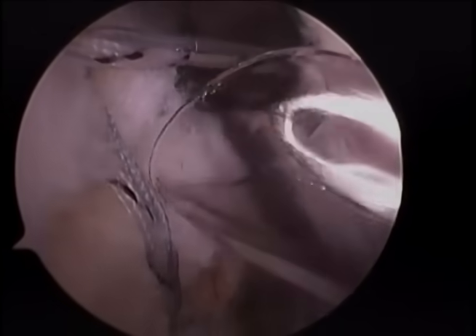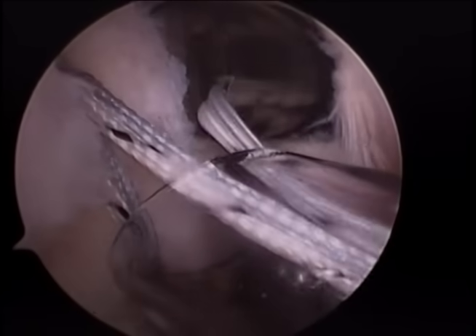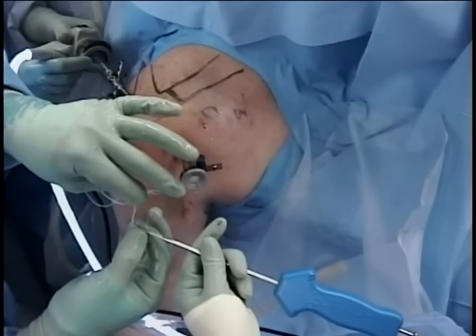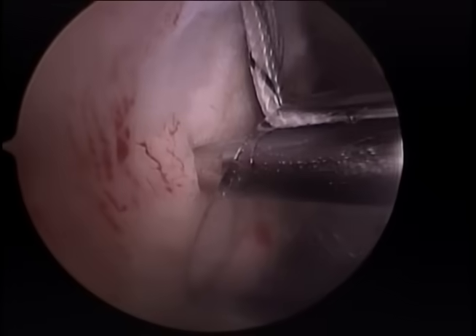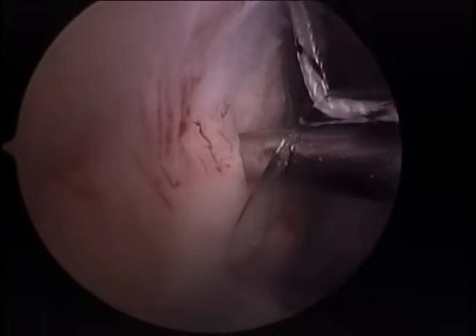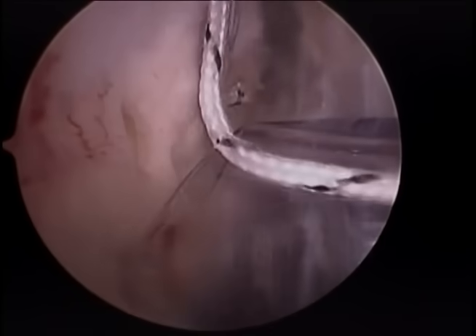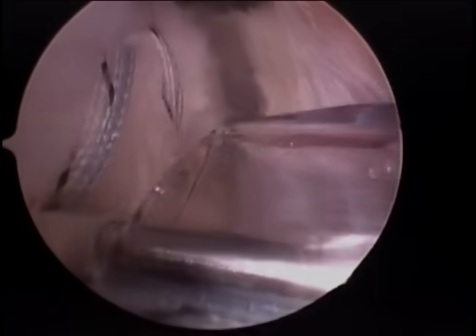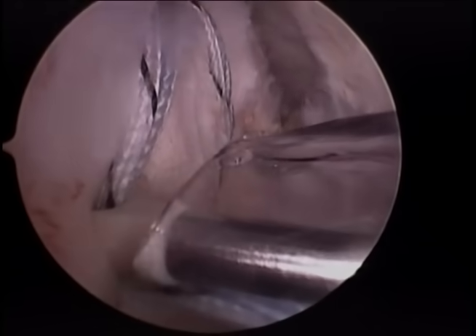We then repeat this step again with the next set of sutures, pulling them out the lateral cannula. Here you see us loading them into the eyelet of the push-lock device. We again make a pilot hole in the lateral cortex with the punch, a good 1 centimeter posterior to our other push lock. We then place our anchor into this hole, pull the slack out of our sutures, and when we are satisfied, we seat our push lock anchor.